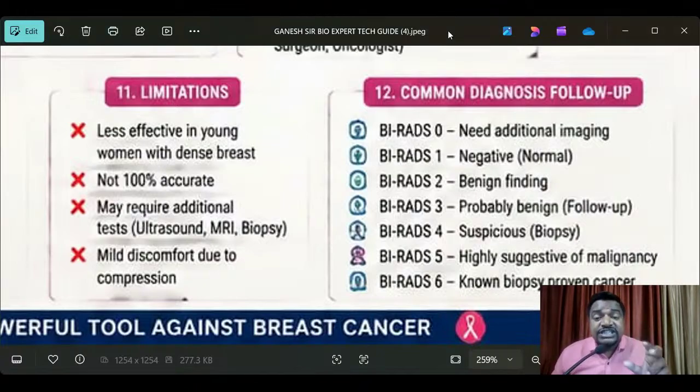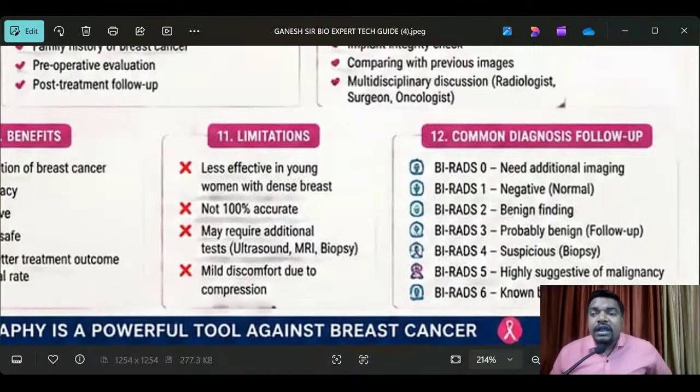See, breast cancer is very important. It is dangerous to a woman's life. Okay, so that is the reason these things are very important when you are going to diagnose. That is the importance of the medical equipment, that is mammography. So we are the luckiest persons. Now we are living in a competitive society with updated technology. Whatever organs we have in our body, for every organ we have a specific, unique technical power. So leading that powerful job really deserves hats off.